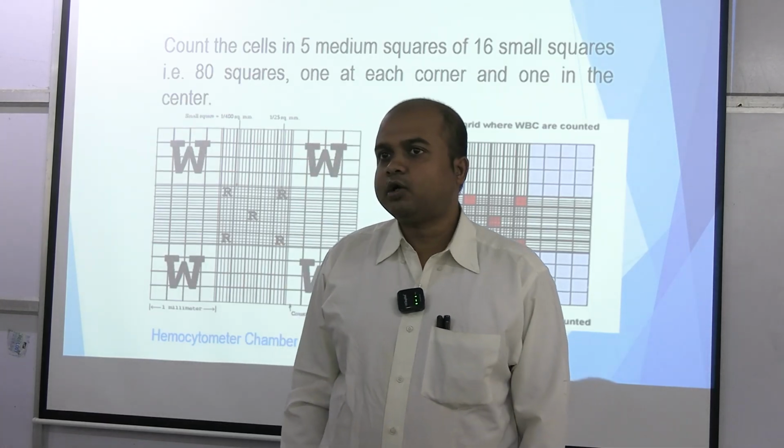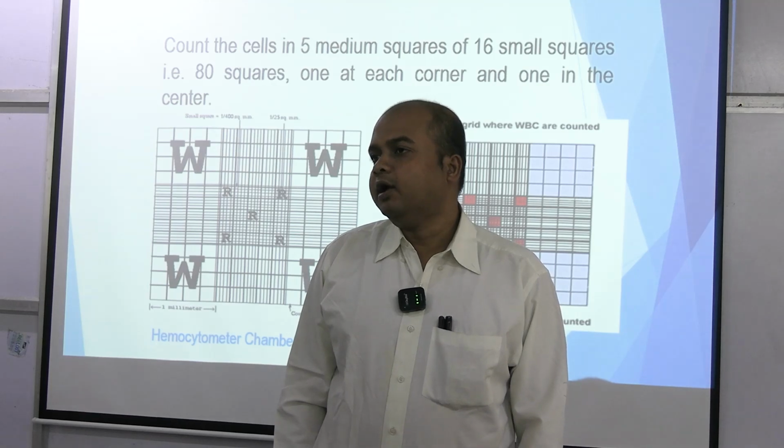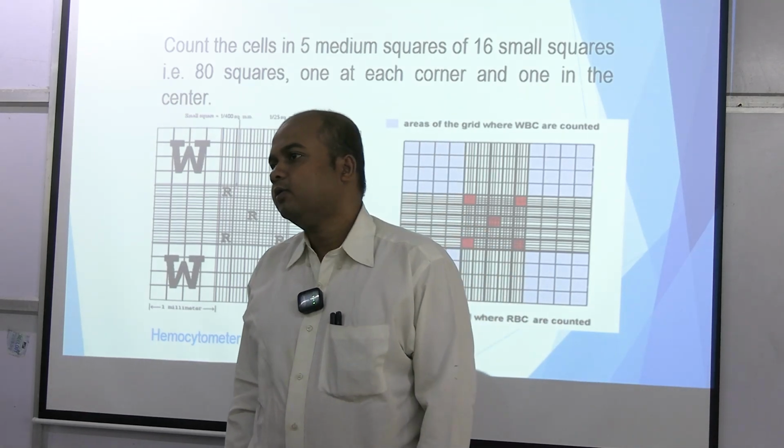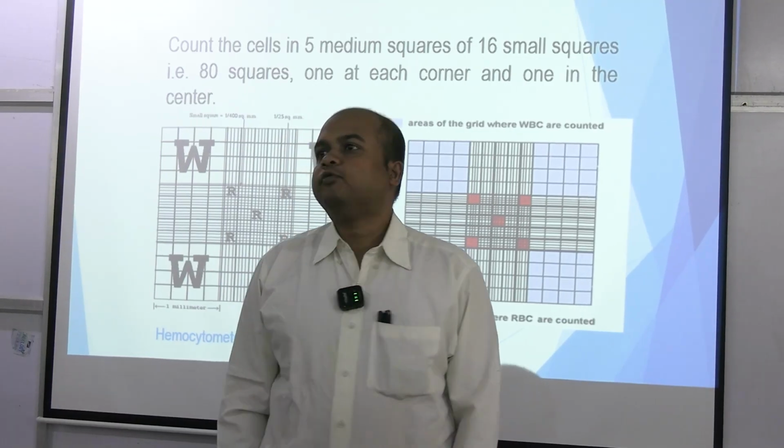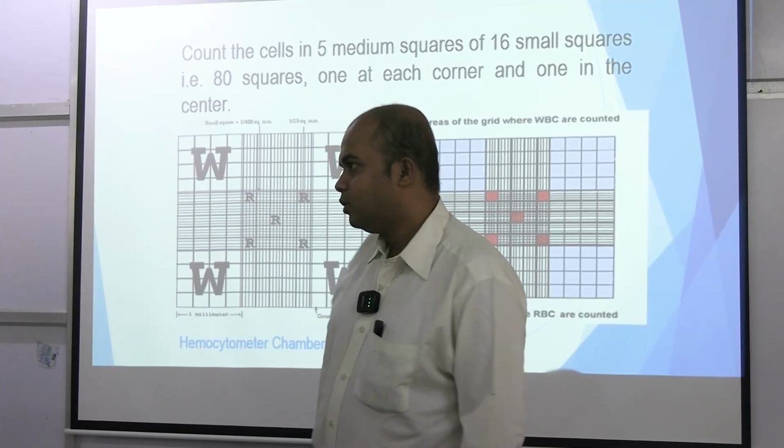What should not be said on record is the back calculation. You expect how many WBCs per cubic millimeter of blood? 4,000 to 11,000. That is the normally accepted value.